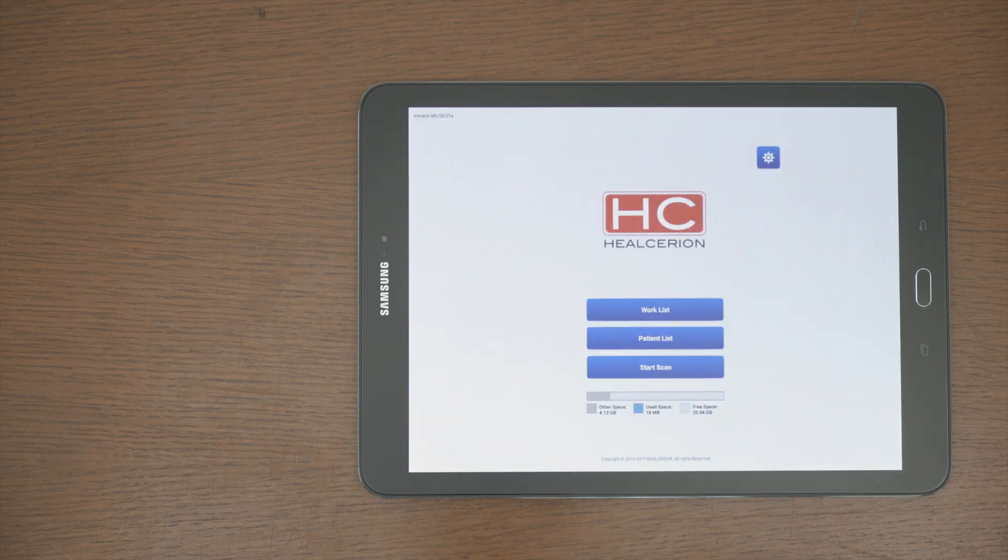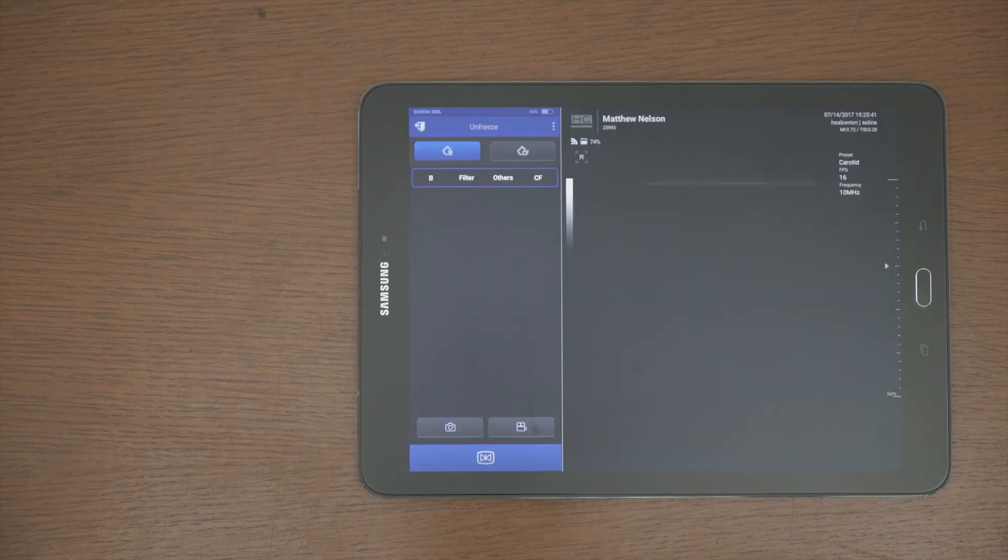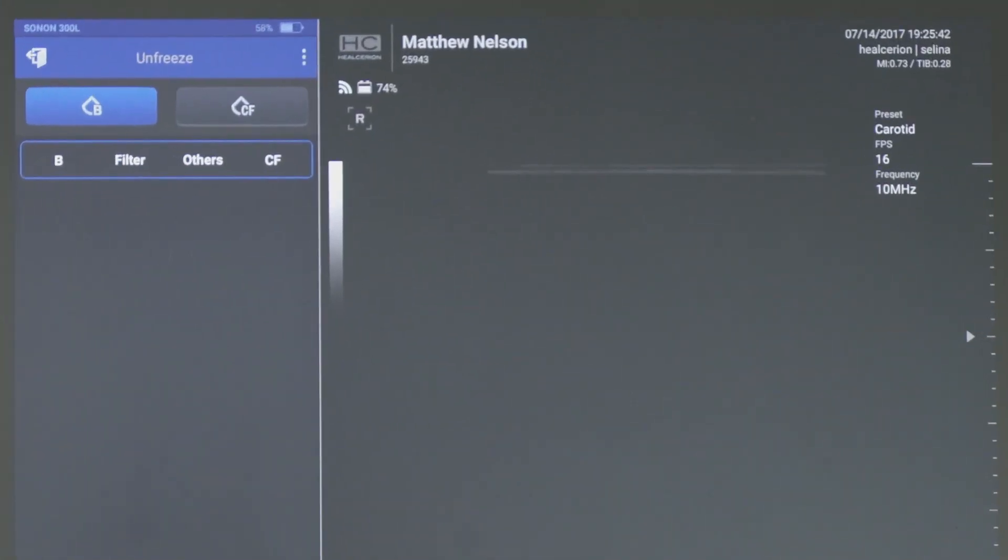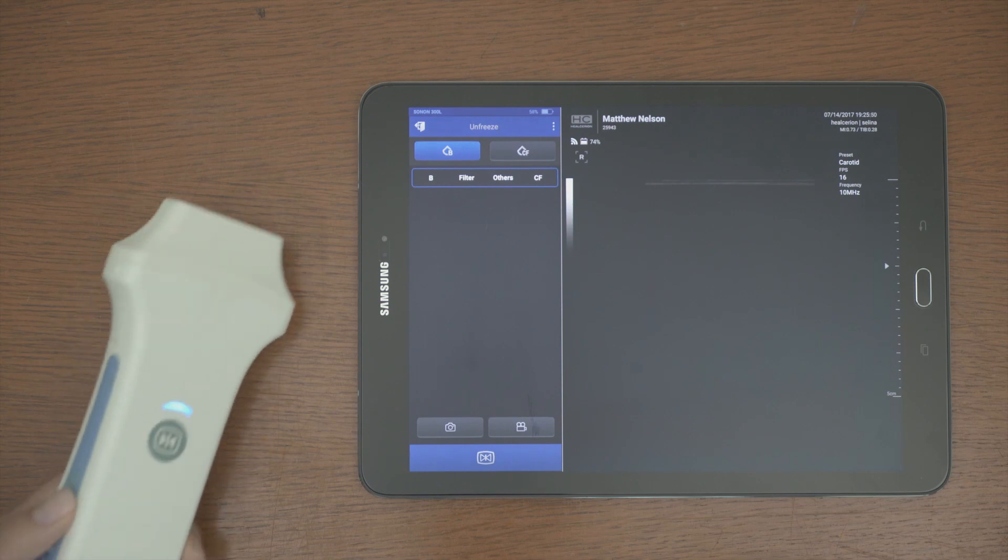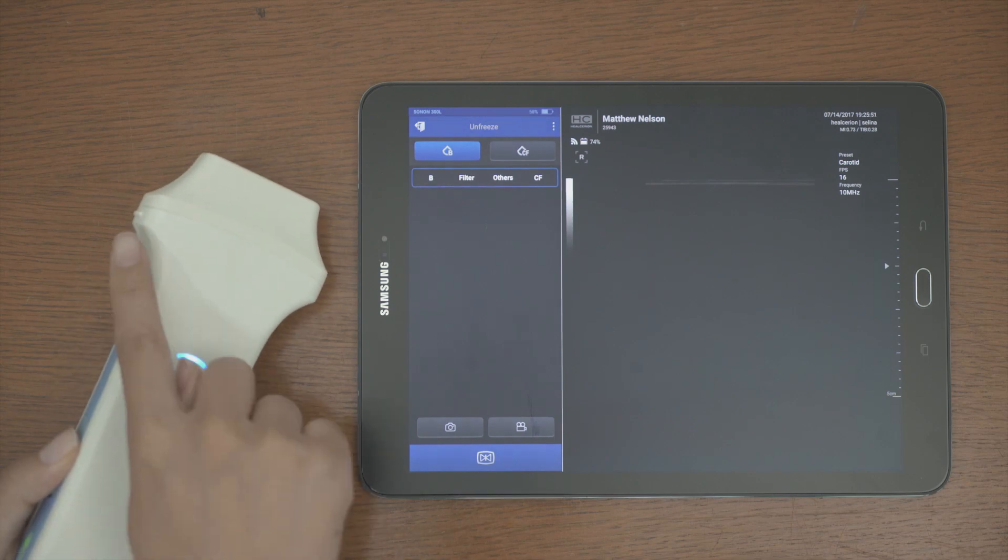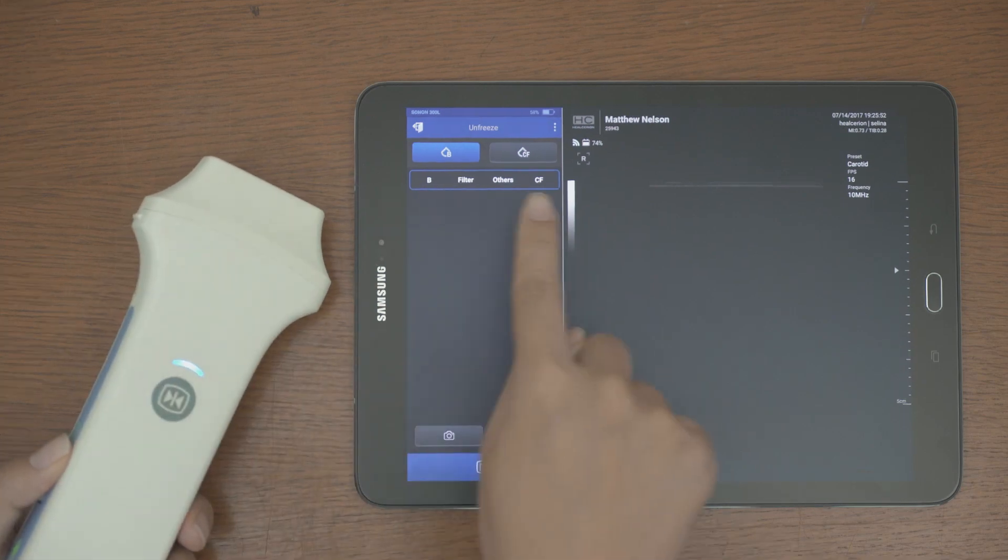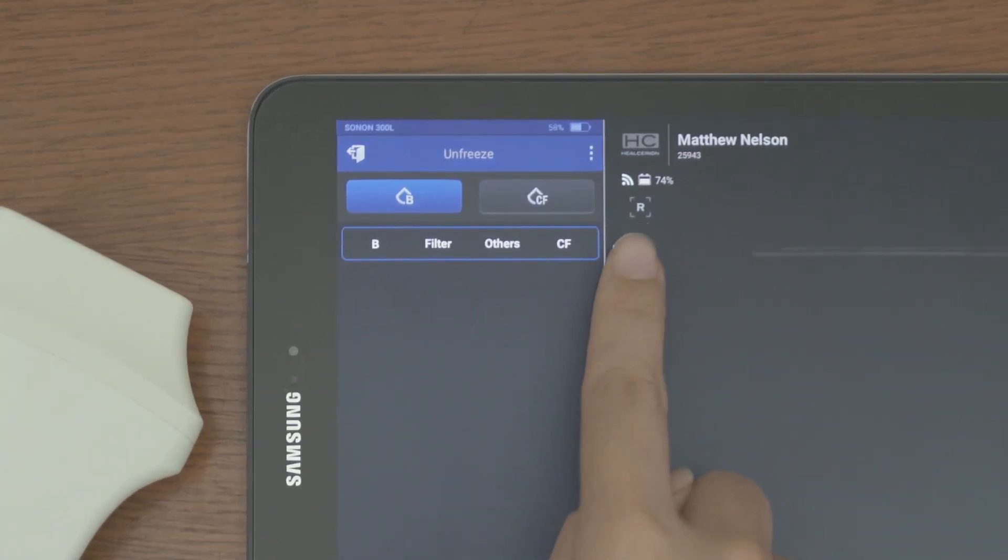The scan screen displays the connection status of the Wi-Fi connection and remaining battery status. Identify the patient's name and ID. And match the R mark to the transducers line one marker.